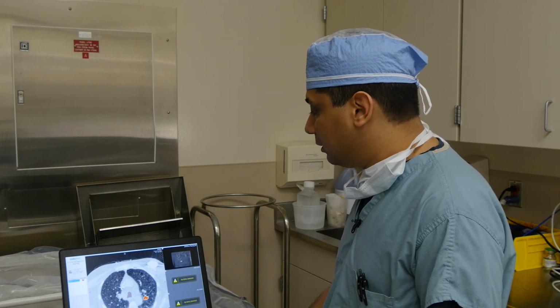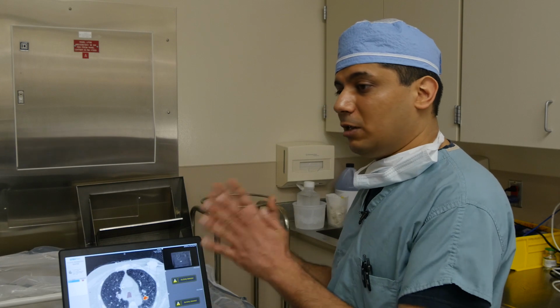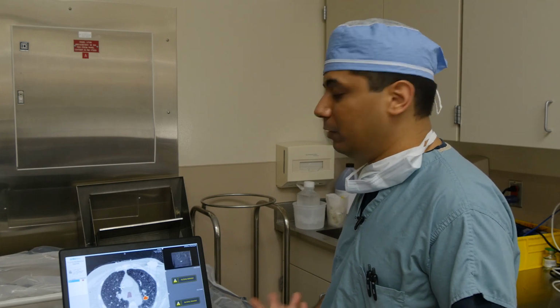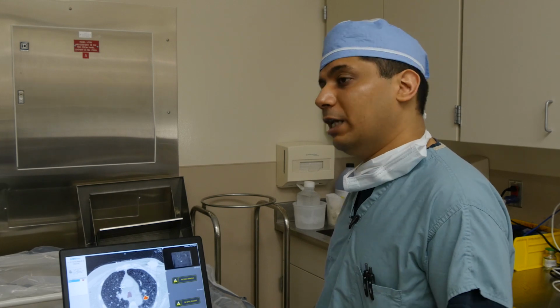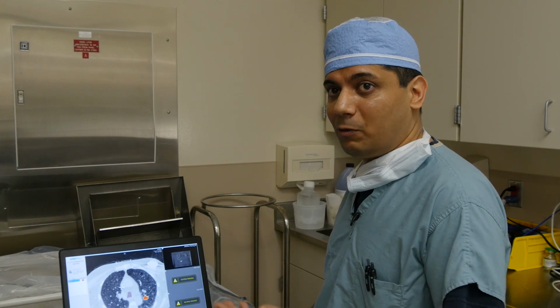And that's what makes these kind of nodules difficult. This is a typical, what we call the middle third of the lung problem. Nodules that are within the proximal 1/3 are easy to get to, with endobronchial ultrasound or if they have an endobronchial lesion. Nodules that are further out, we can either get with navigation, but if we don't, we can get with a CT guided biopsy or other ways.